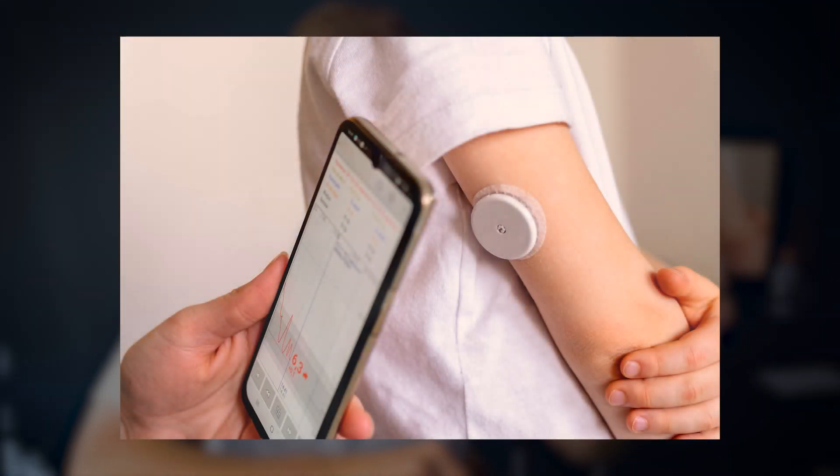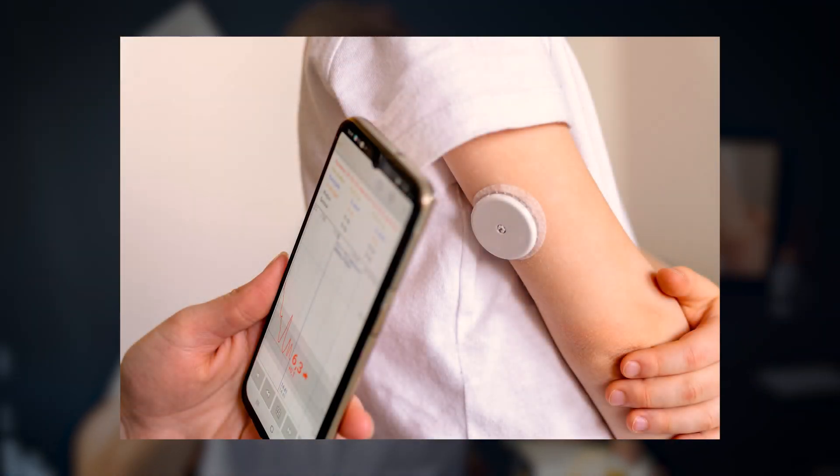Some of you have glucose monitoring devices, and I want to show you — this is the Libre 2. It has a big instruction manual, but I mainly use it to tune up my blood sugars, to help me know what foods I should be eating, when, how much, and how exercise is helping my blood sugar. For me, what helps the most is knowing what times of day and what foods really spike me and what foods do not.